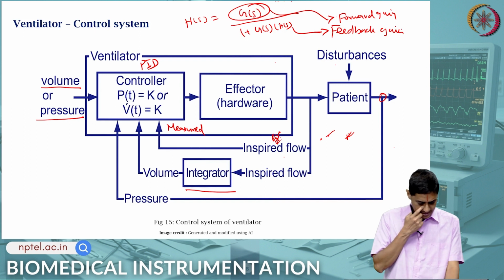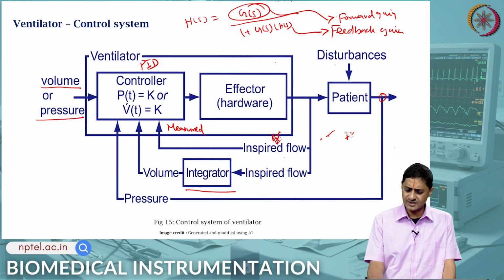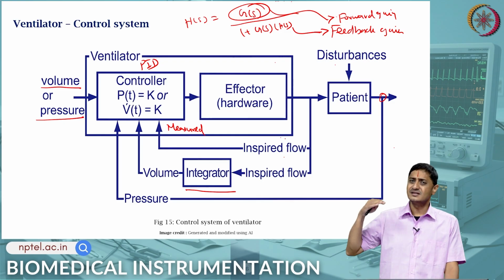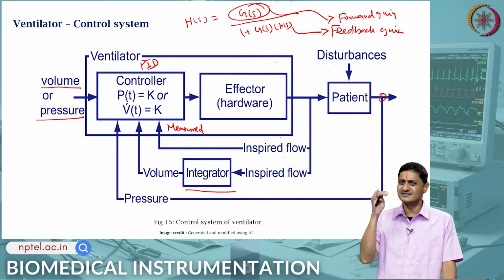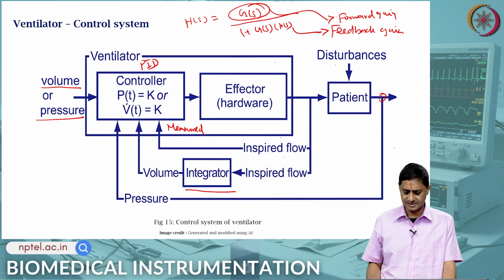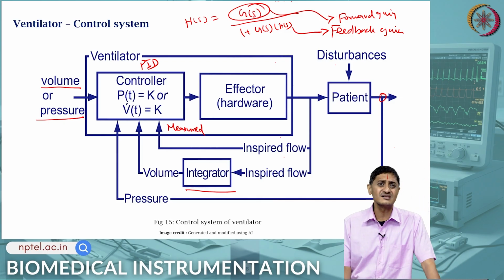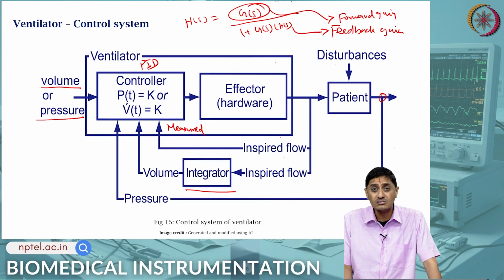Okay, something to keep in mind. Now compare this to your AC HVAC system or a thermostat. You have a set point, the AC keeps cooling until the set point is reached, after which it will stop cooling. What you need is a smoothly operating system, for example comparable to a cruise control.